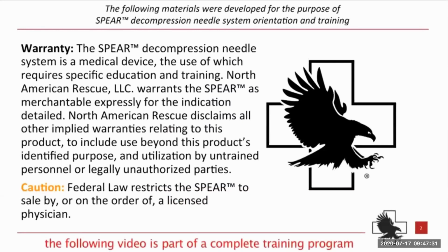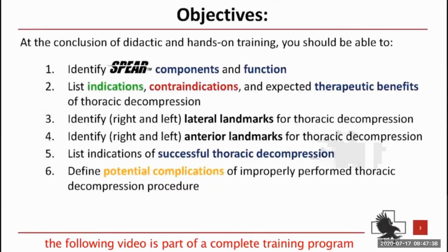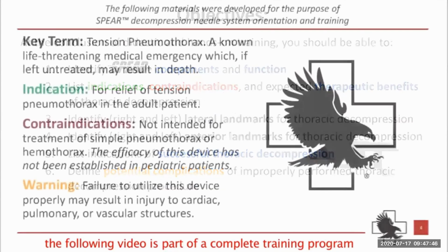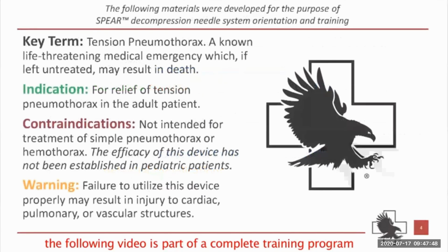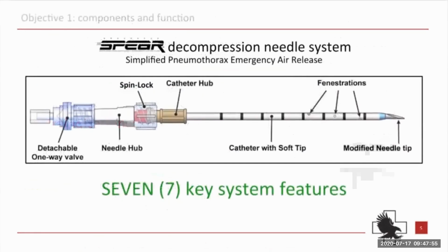The following video is part of a complete training program. Each of these objectives is designed to ensure safe SPEAR usage. Indications, contraindications, and therapeutic benefits are important facets of safe SPEAR usage. Identify 7 key features of the SPEAR decompression needle system.